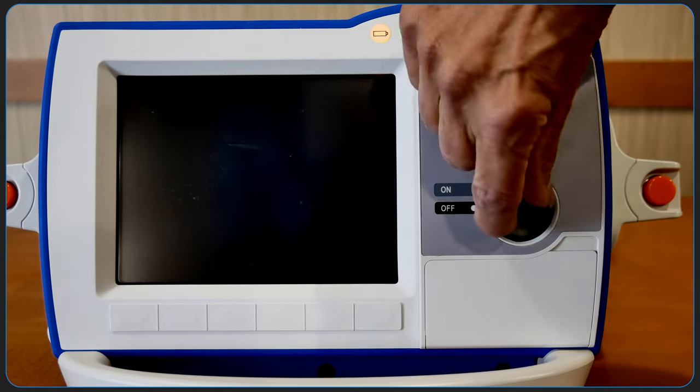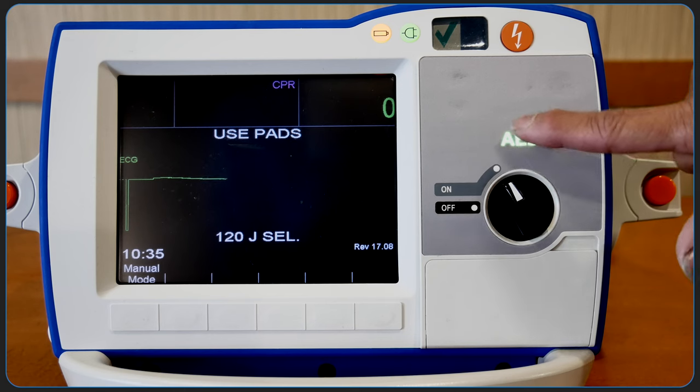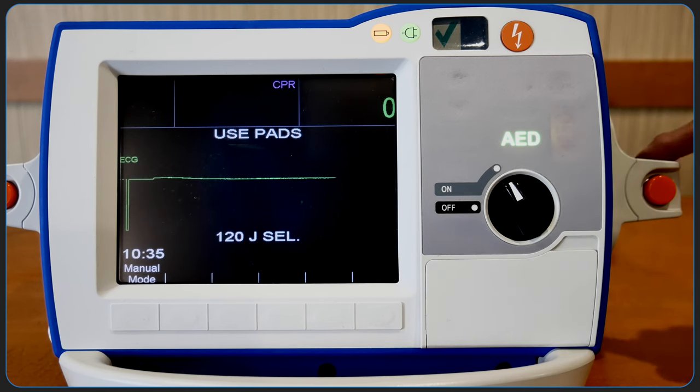Turning on the unit with the mode selector in the on position defaults to AED mode. AED mode can only be used with the multifunction electrode pads and not with the external paddles.